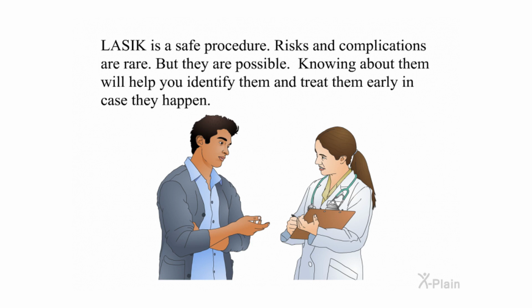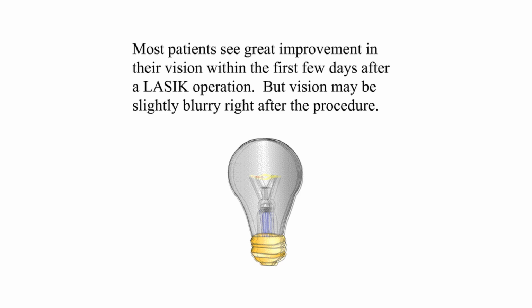LASIK is a safe procedure. Risks and complications are rare, but they are possible. Knowing about them will help you identify them and treat them early in case they happen. Most patients see great improvement in their vision within the first few days after a LASIK operation, but vision may be slightly blurry right after the procedure.